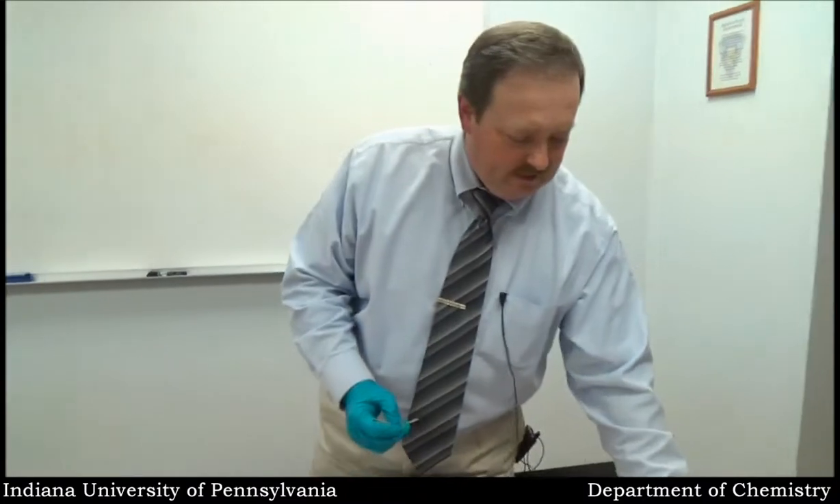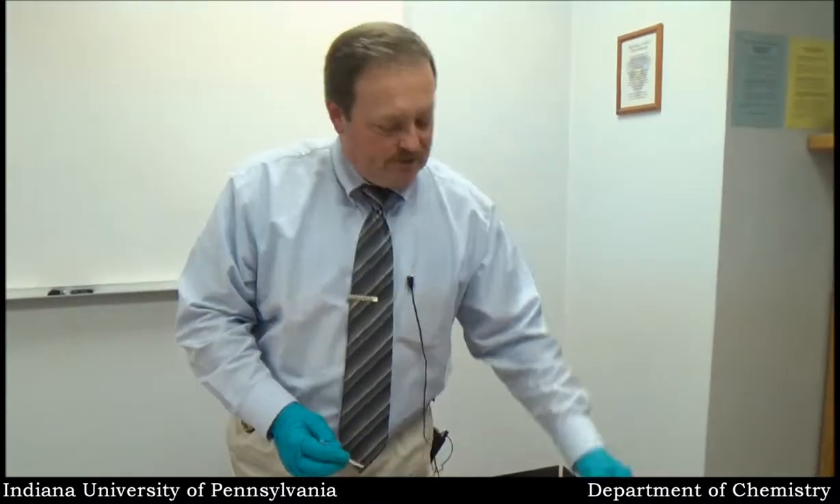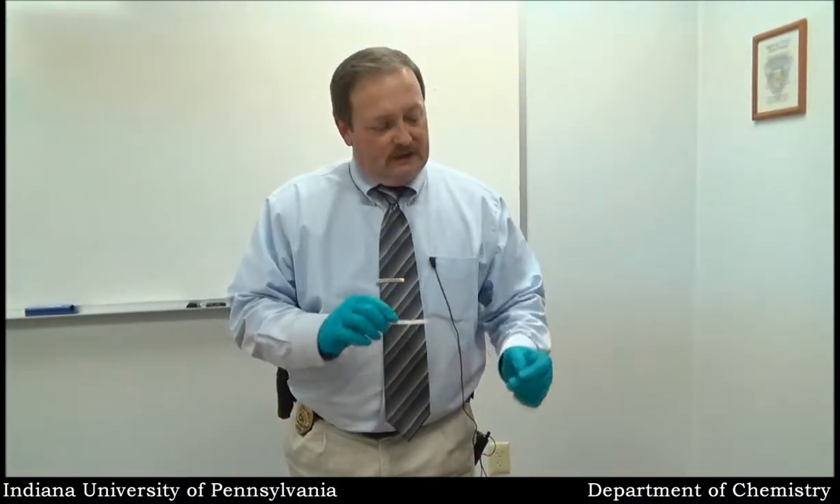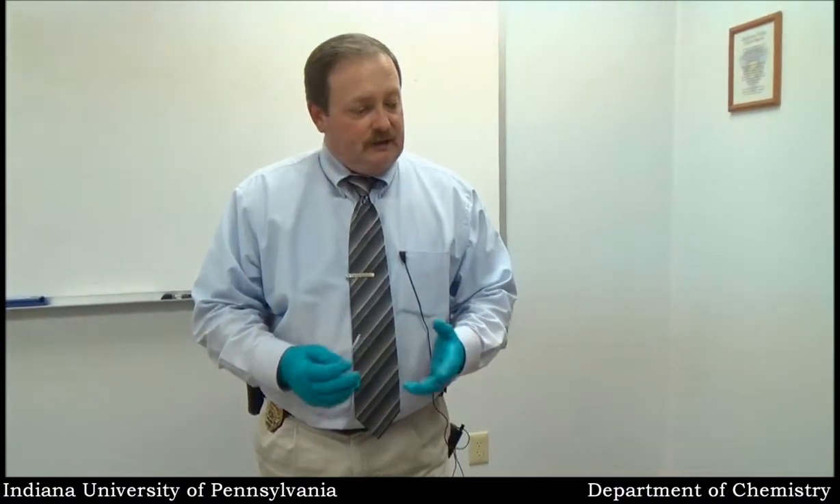I'm going to try these presumptive tests for drugs using a different style of kit. I didn't get the results I was actually looking for with these two kits. Could be a number of reasons for that — could be the fact that the quantity of the product I placed in the kit was more of a cutting agent than it was the actual cocaine product. Could be the kits are old. These things have expirations like everything else. I'm going to try a different kit.